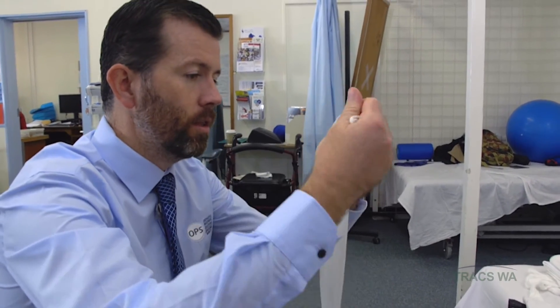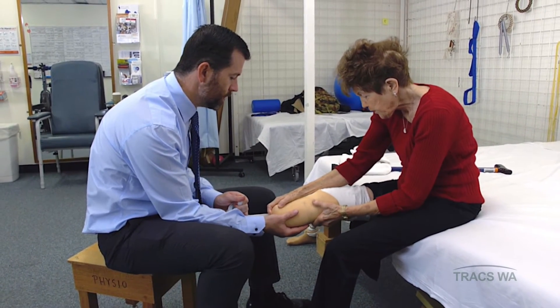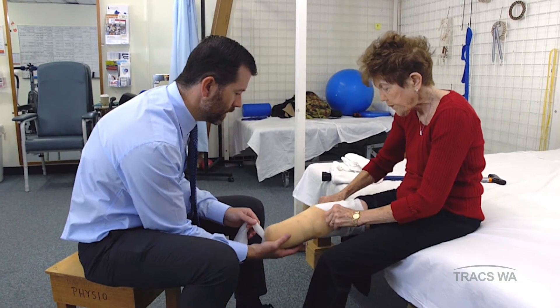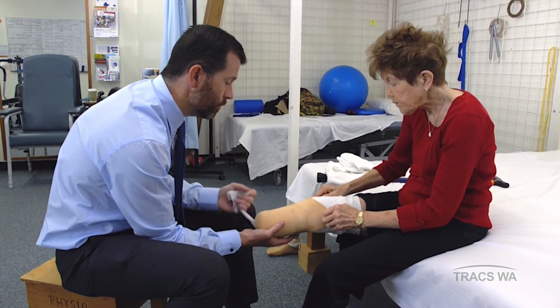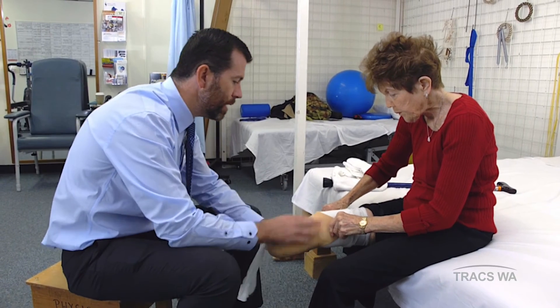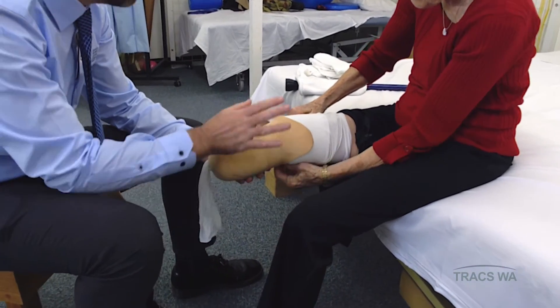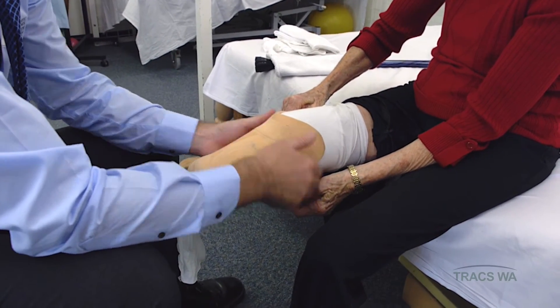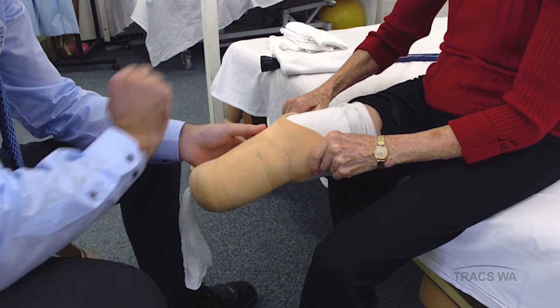So we're putting on the liner again with the nylon pull-through sock, put on just past your knee. You're pulling on the liner — this has got to come up at the front. I provide some gentle tension through the bottom of the nylon and that allows you to slide the prosthesis up. I can also hold the liner and with a gentle pull down you can feel that your skin wriggles down to the bottom of the socket. At that point we can feel that your kneecap's dropped down into the hollow, no gap down the bottom and we're now in position. It's much easier to use your kneecap and the base of the liner as the centre reference point.